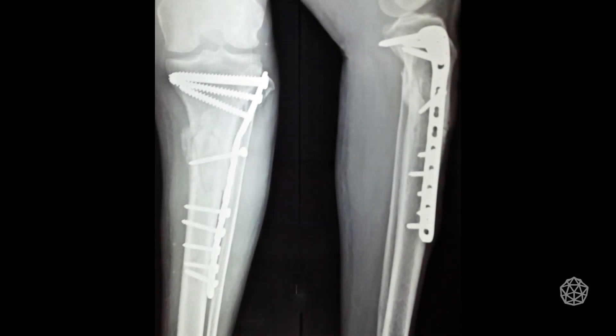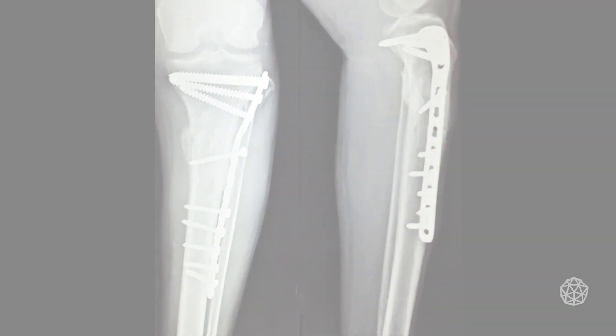Whenever you break a bone, you get either a titanium, stainless steel, or cobalt chromium implant — plates, screws, and rods. The problem is that when you put these types of devices inside your body long term, they create all kinds of long-term complications. For example, one speaker has two screws in his elbow that have started to hurt every time he carries a gallon of milk or unloads the laundry.